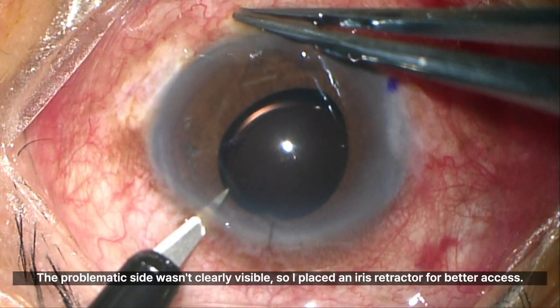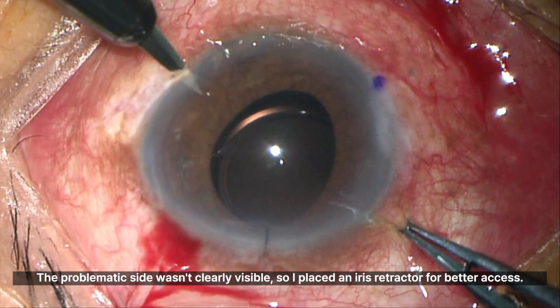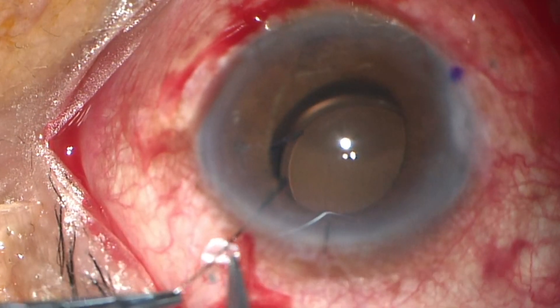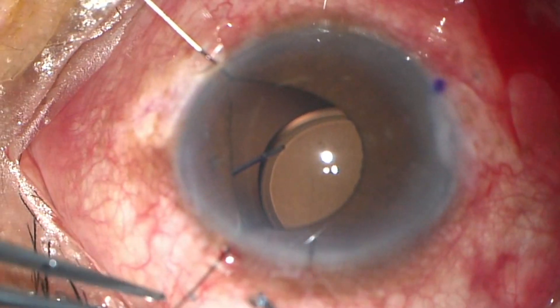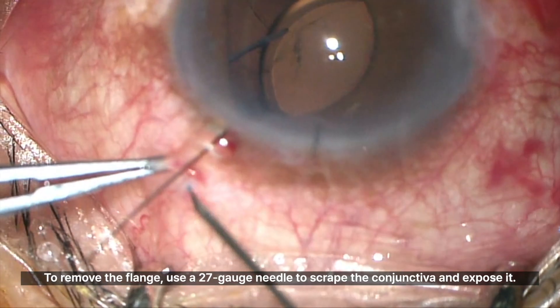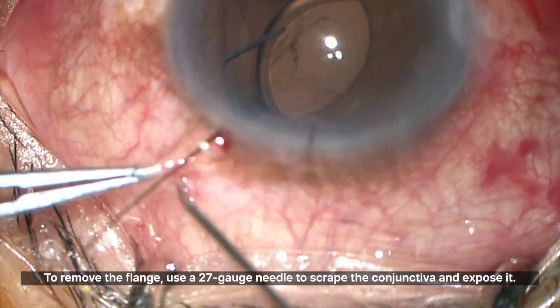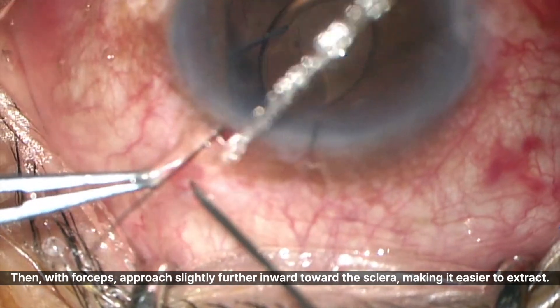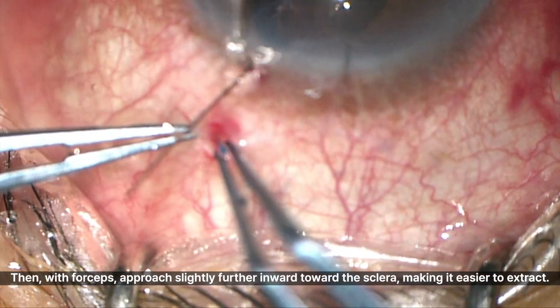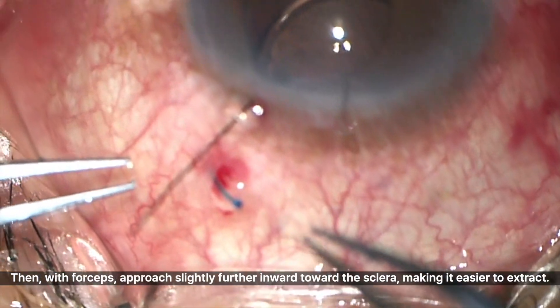The problematic side wasn't clearly visible, so I placed an iris retractor for better access. To remove the flange, use a 27 gauge needle to scrape the conjunctiva and expose it. Then, with forceps, approach slightly further inward toward the sclera, making it easier to extract.